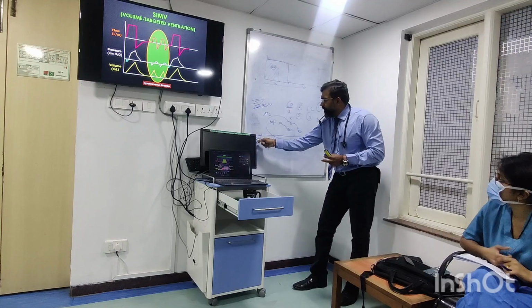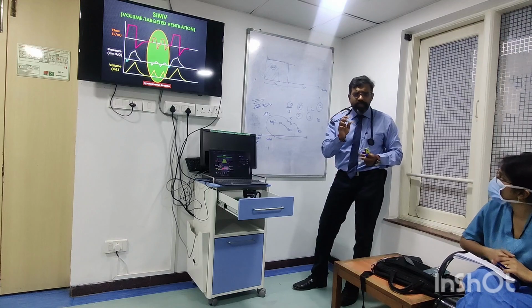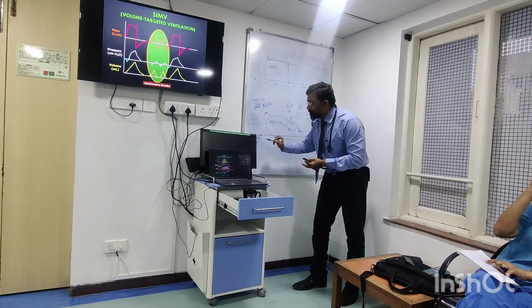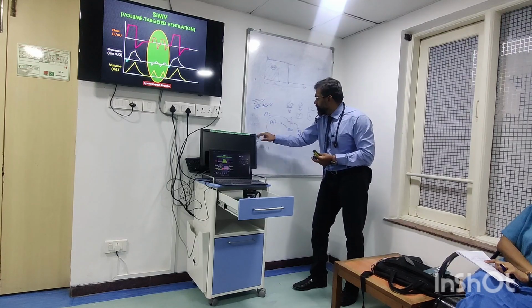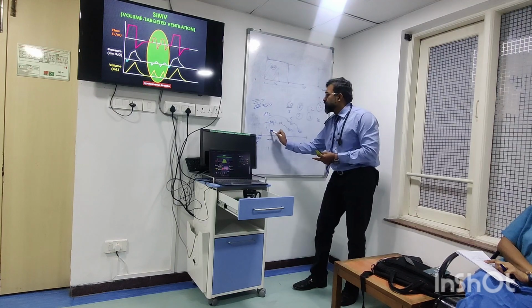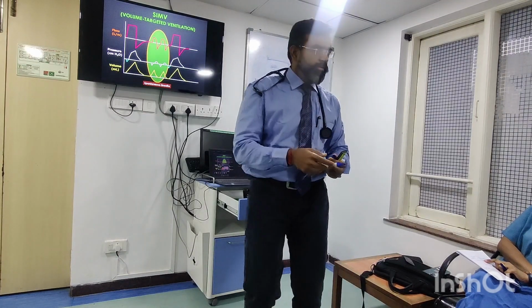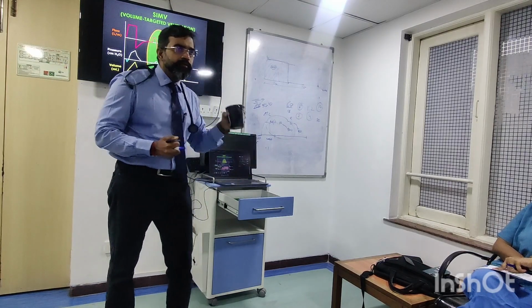It will wait in the inspiratory phase for a certain period, which is a formula set by different softwares. In this period, if the patient takes a breath here, the ventilator will give the breath. In the event that the patient does not take a breath here, it waits till here, and once it reaches here, it gives the breath. That is how it is synchronizing the patient trigger to the machine. Clear? You have an SIMV period and a mandatory period.